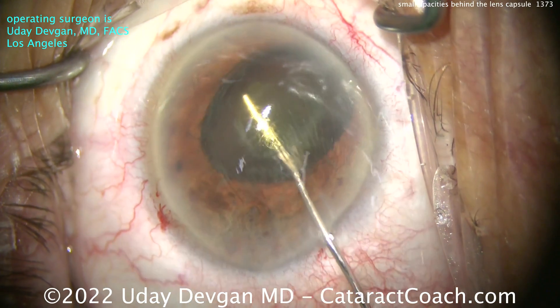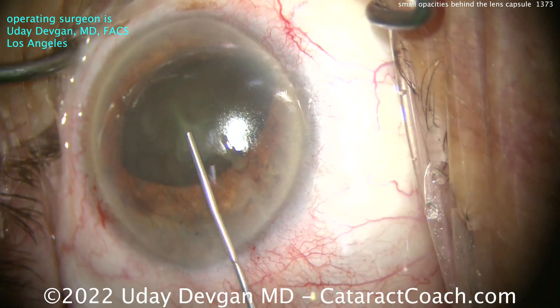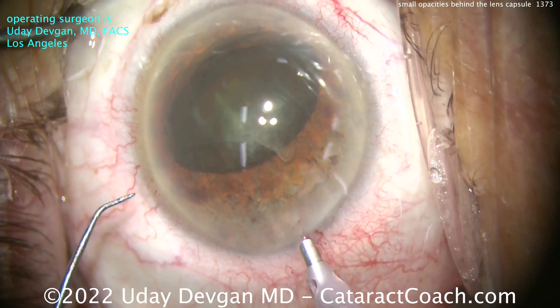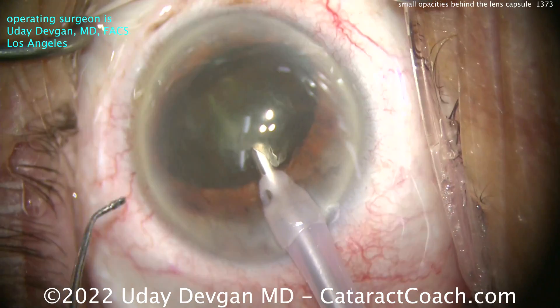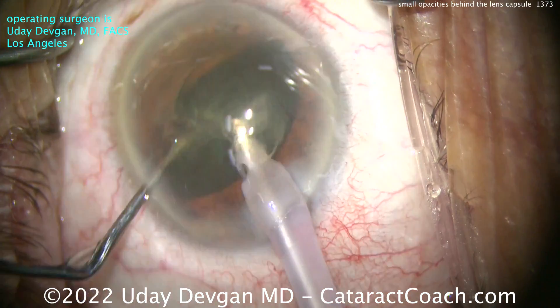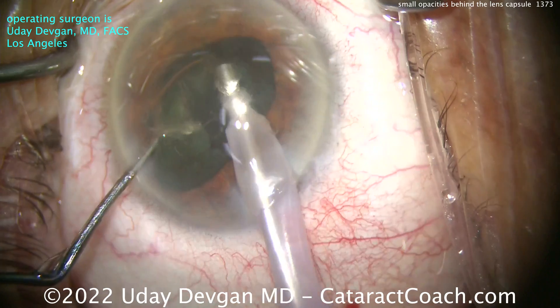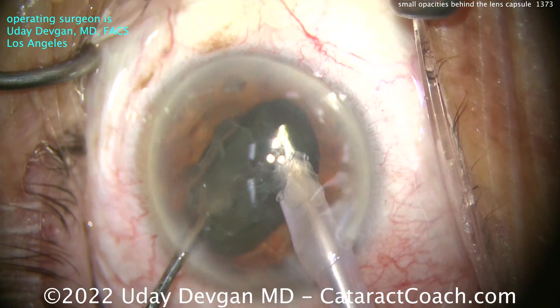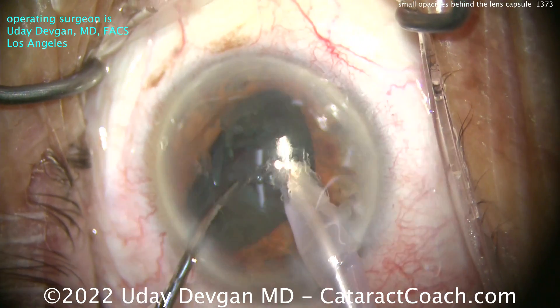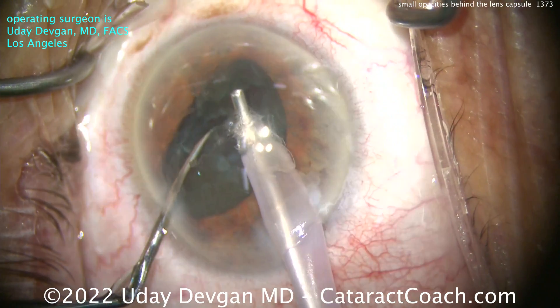You might think we're just moving big pieces of cataract, but using ultrasound in the eye, we're going to blast this cataract into an emulsion — phacoemulsification. It's literally emulsifying it into really tiny microscopic fragments. Some of these, during the flow in the eye — the BSS irrigation — can be pushed through the zonular support, especially if there are areas of zonular weakness, laxity, or prior trauma, which this patient did not have. Then you can get tiny pieces or fragments of lens material in the anterior hyaloid face, behind the posterior capsule.